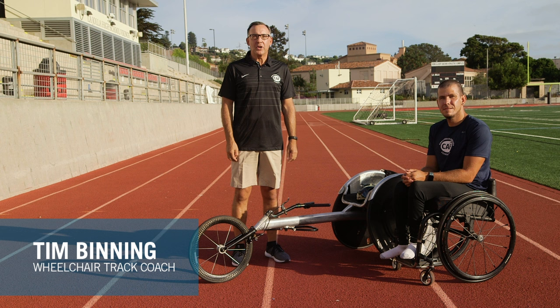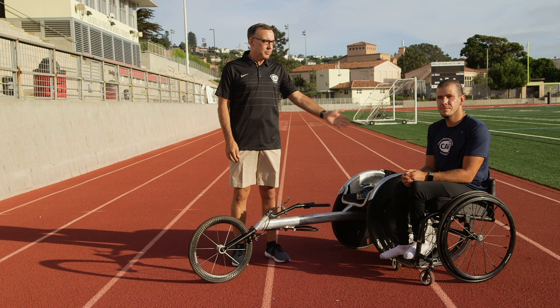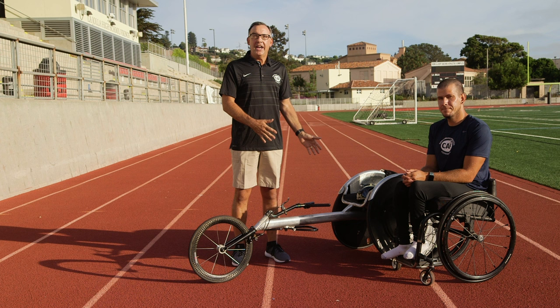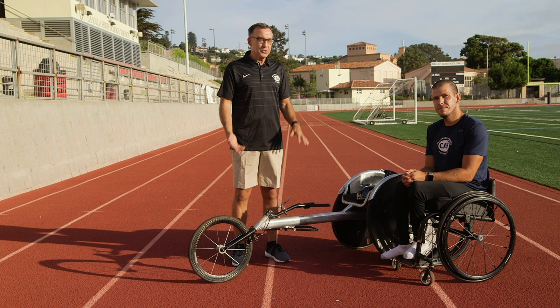Hello, I'm Tim Binning, wheelchair track coach at Arizona Disabled Sports, and I'm here on behalf of the Challenged Athletes Foundation with my good friend, two-time Paralympic sprinter, Eric Hightower. We're going to show you today how to transfer from your everyday chair into your racing chair, and then once you're in the racing chair, what would be the optimum seating position to have so that you have the most efficient stroke possible while you're racing in your chair.